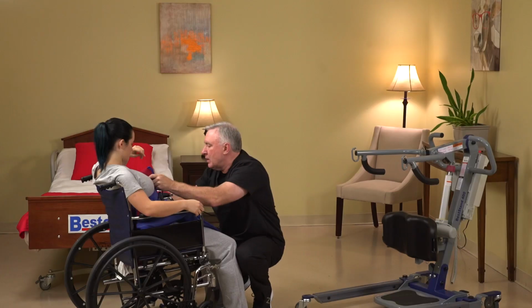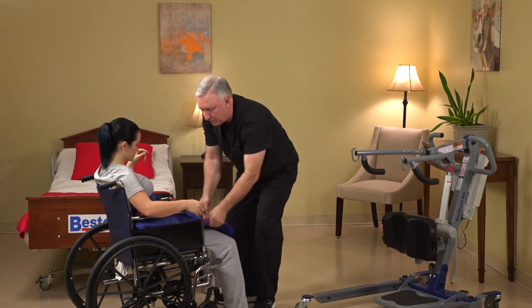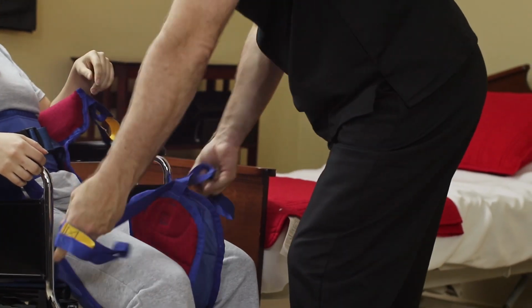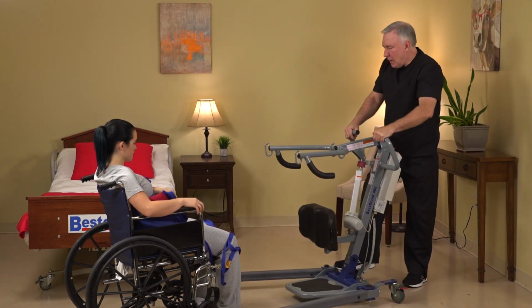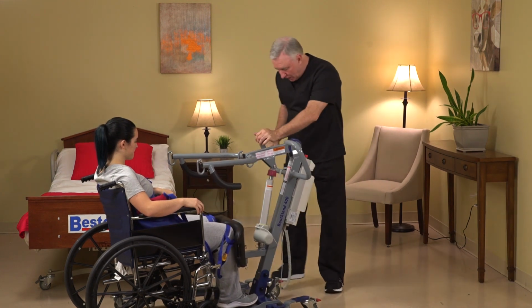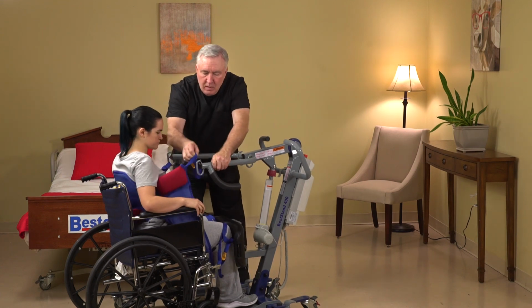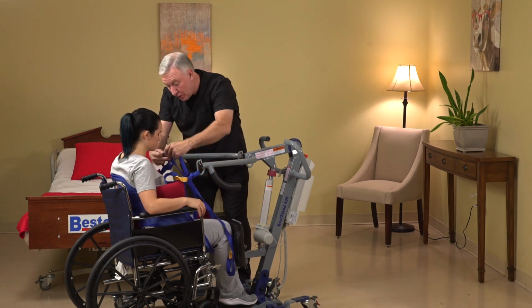But we have leg straps that go around the hip and under the leg on both sides of the patient. We crisscross the sling at the bottom. Now we're going to approach the patient with the BestStand. Open up the base. Same kind of maneuver where the knee brace is up against the knees. Lock the wheels. We're going to connect the upper portion of the sling to the hooks. And the lower straps to the same hooks.